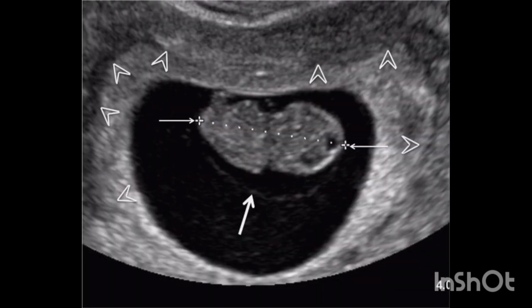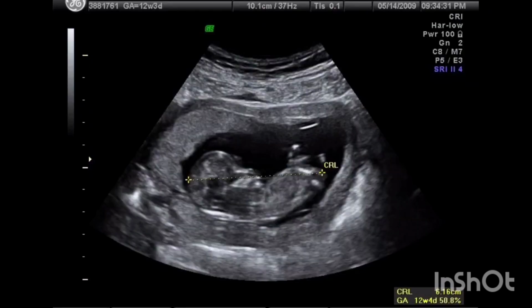The crown rump length is predictive of fetal age, with an error of 3 days, 90% confidence limits, from 7 to 10 weeks, and of 5 days from 10 to 14 weeks gestation. The crown rump length grows approximately 10 mm per week from weeks 8 to 12.